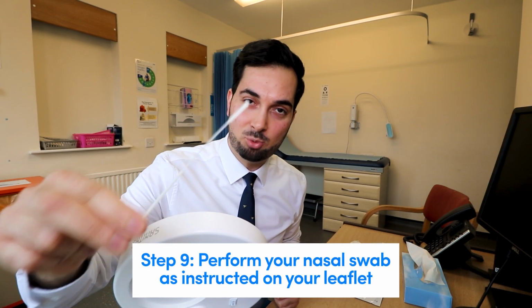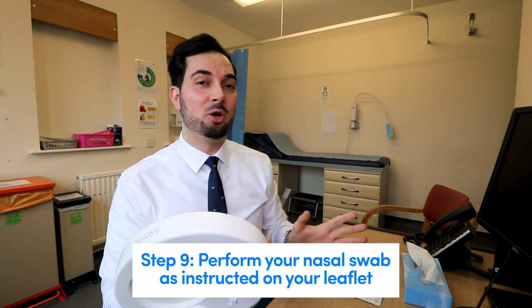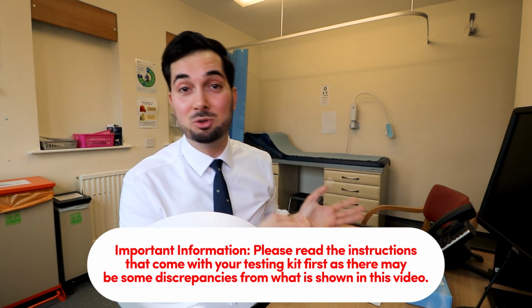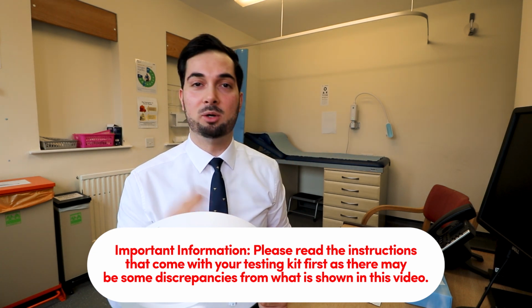So moving on to step number 9, as you can see, I've still got the swab, the same swab that I've used on my throat, in my hand, ready to go. So again, this bit differs depending on your testing kit. If your testing kit tells you to do a throat swab, which we just did, followed by a nasal swab, you only usually need to do one nostril. However, please read the information leaflet because it might tell you to do 2. So I'm not too sure what your testing kit will tell you to do, but usually it's only one nostril if you've done a throat swab.